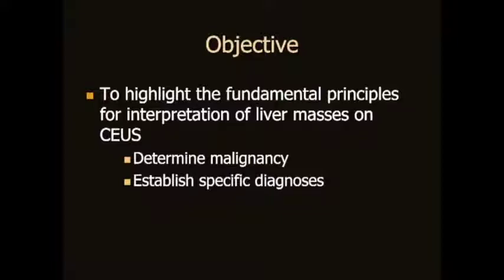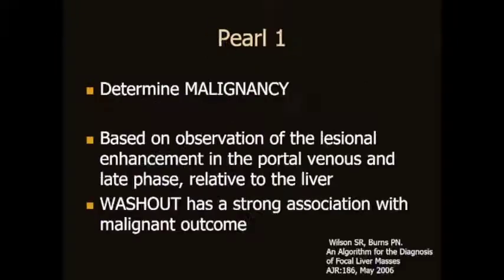And although I hope that this talk is not too elementary for some of you, I hope that many of you are going to start to do CEUS in your departments or have just started. And so this is really what you need to know to interpret these masses. So I've called these ultrasound pearls. So what's pearl number one?